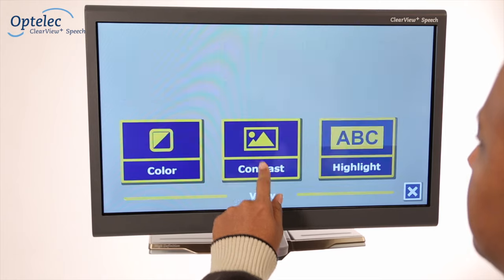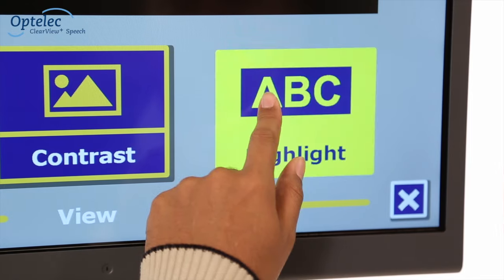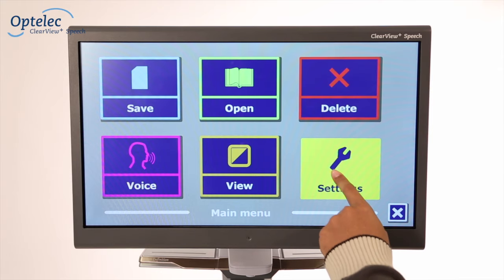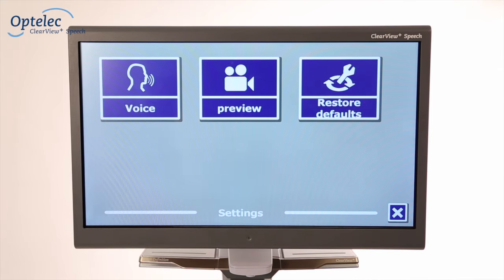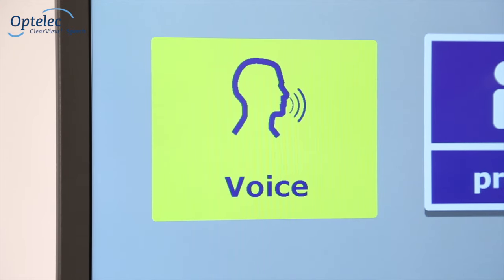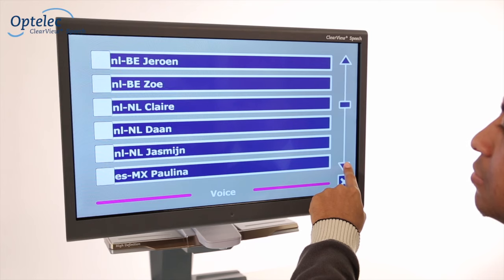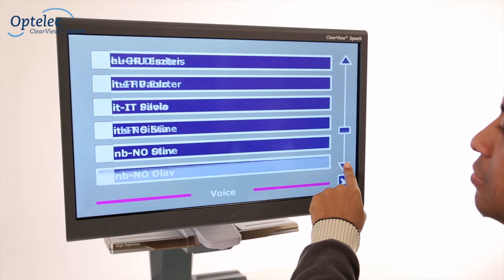The Display Options submenu allows you to adjust the settings for contrast, text colour and the read-along function. The settings menu also allows you to activate or deactivate additional reading voices. In total, you have over 50 voices to choose from across 30 different languages.